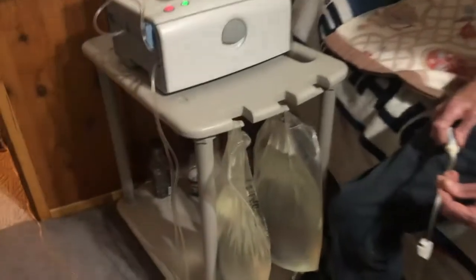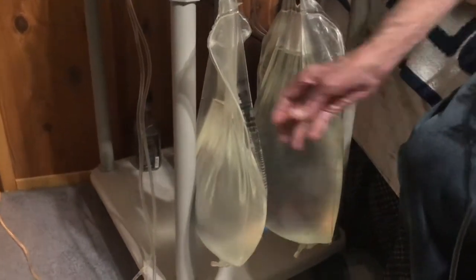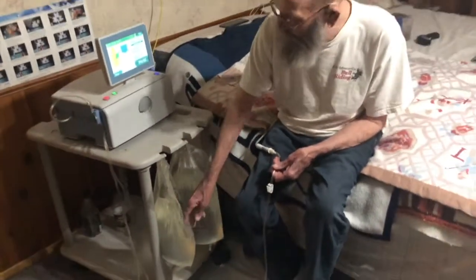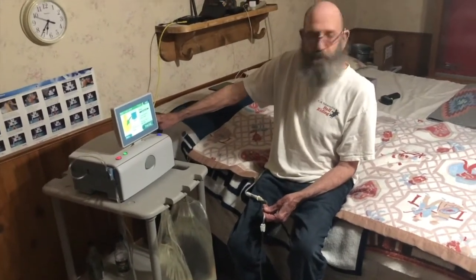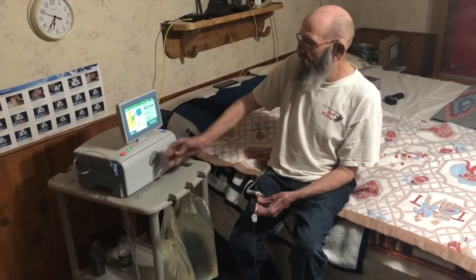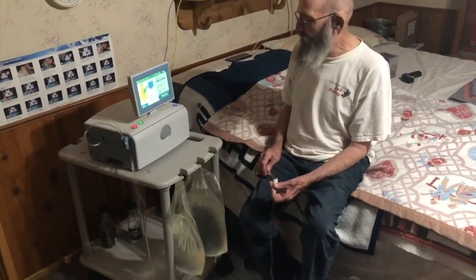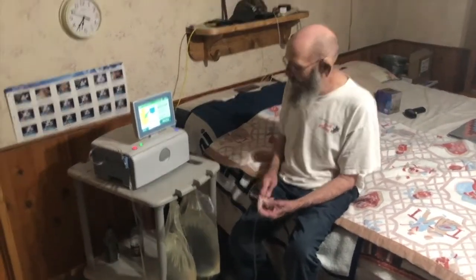So this is the fluid, these are the bags right here, right? This is my prescription, these 2 bags. There's 6,000 milliliters in each bag, and it takes fluid out of this first bag first and uses it. There's a heater in this thing that heats the water up for me. And this door here, when you open it, I'll show you tomorrow, the cassette goes in there, and everything that happens with this machine is controlled by that cassette.